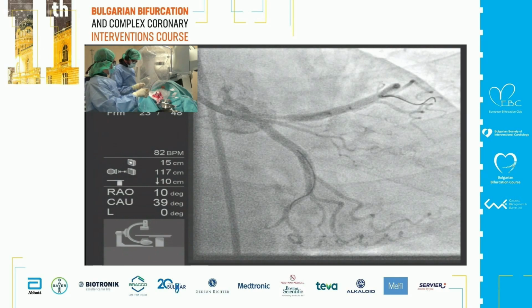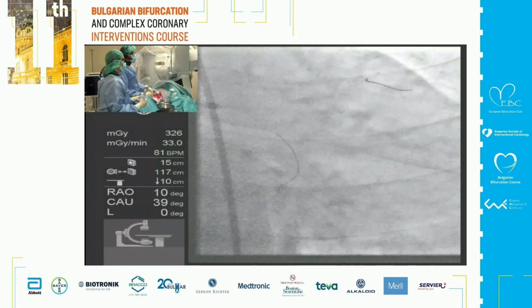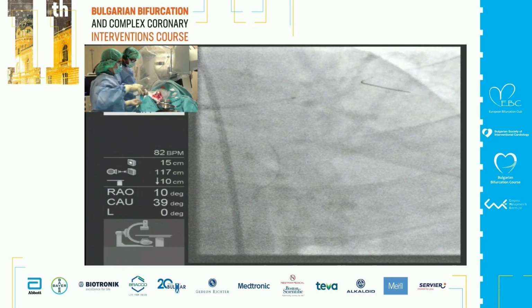Eva, did I hear correctly that you said 38 length? 28. Okay, 28. We discussed between 26 and 24. Eva, can I ask you something? Do you think that the wire in the circumflex is absolutely necessary? Oh yes. You know, this is a principle of the angle.